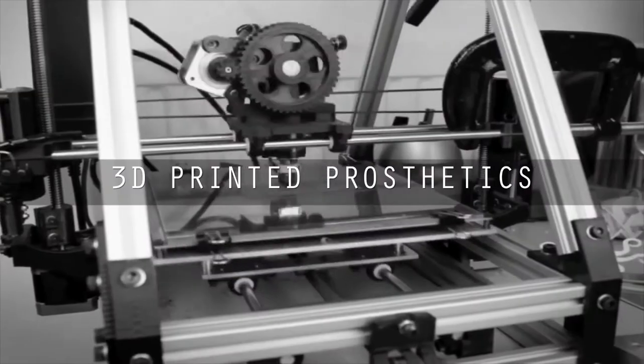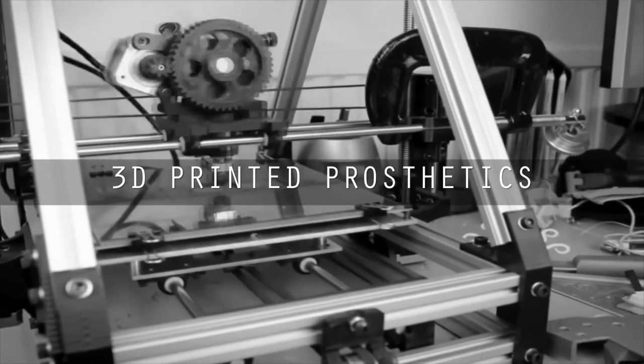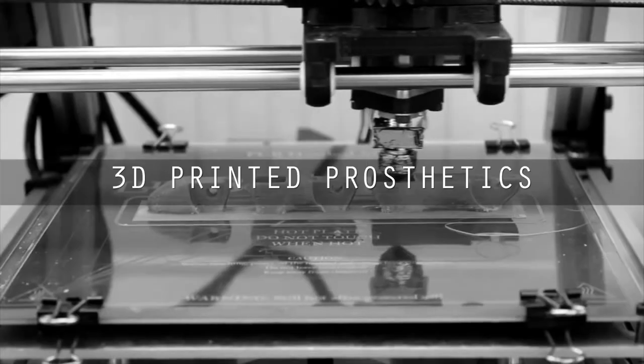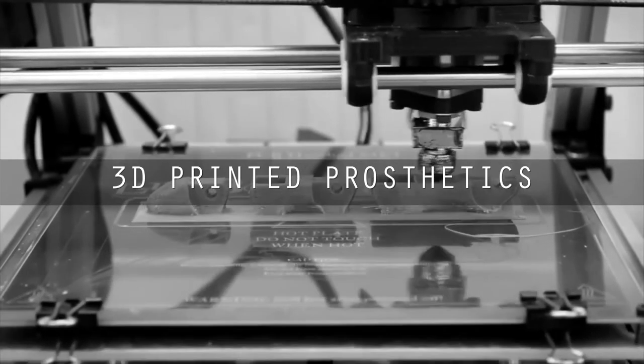And the thing that these 3D printed prosthetics do is threefold in one way. They solve three key problems. One, the cost. And we're going to talk a little bit about some of the media exaggeration around cost on this panel. Two, they solve a very specific problem when it comes to children who outgrow their prosthetic limbs very quickly, and they're developing both psychologically and socially, and often these larger limbs that are available on the market are not always appropriate.